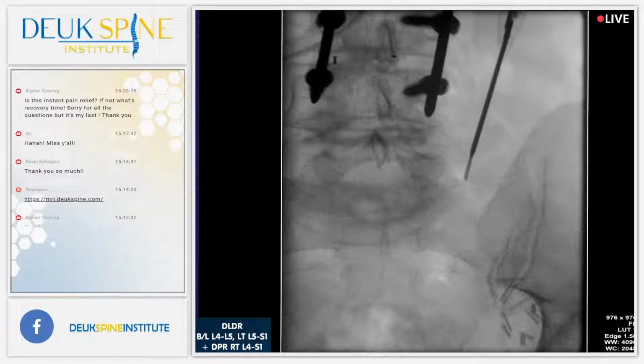Done. Great job, everyone. Good job, Luis. Great job. We're done. We did our DPR. Patel's coming in to do the sacroiliac joint DPR.